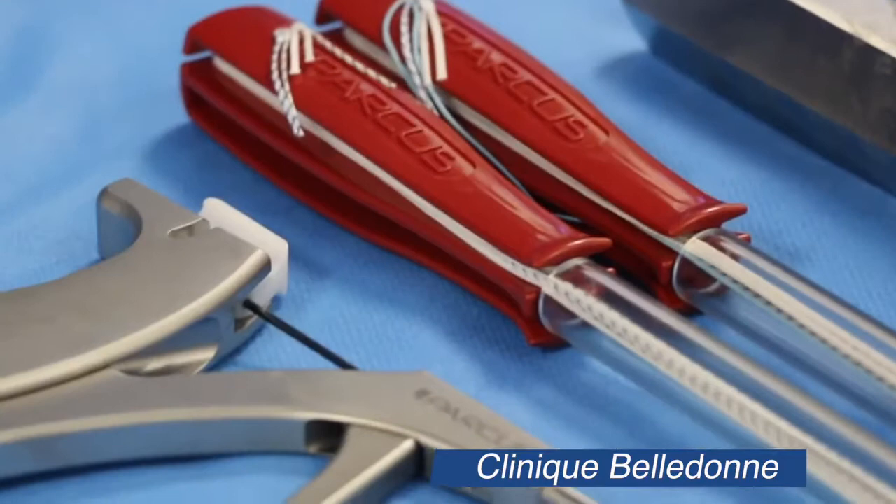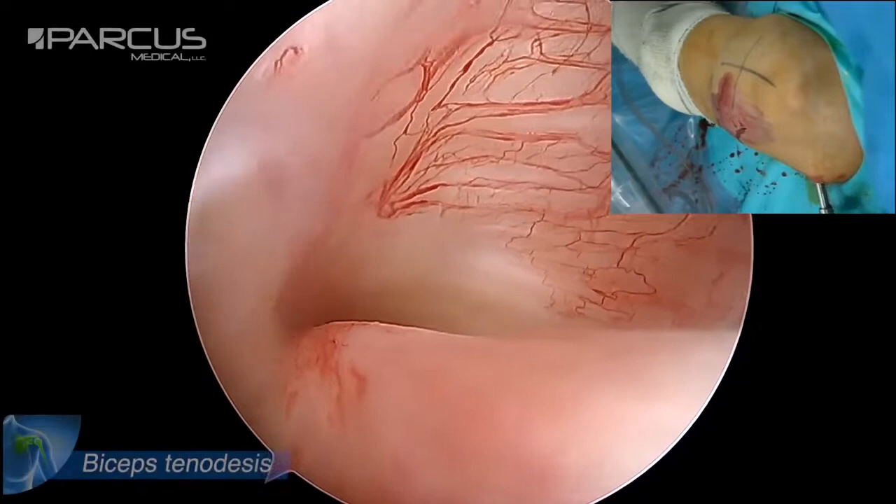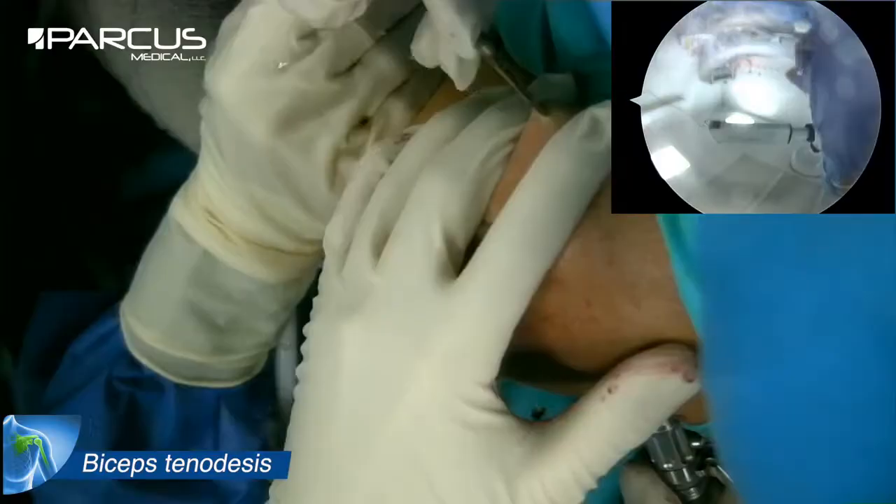Since 2010 at the Belledonne Clinic in Grenoble, I'm a shoulder surgeon and I've been using Parcus devices for several years, which combine efficiency and simplicity. This is a subluxation of the long head biceps with tenosynovitis in a 49-year-old patient. We are going to fix it using the needle loop tenodesis technique.